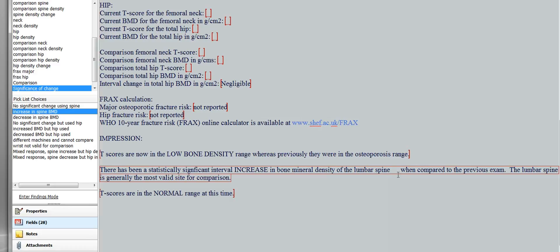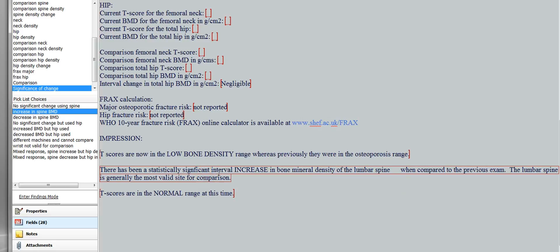I can't put a field or a pick list within an impression, so I just left a blank there. So here what you want to do is you want to enter in this blank, you'll put your cursor there, click it, and then speak in, and you'll give the bone mineral density in grams per centimeter squared and the percent change. So in this case, it's that there's been a statistically significant interval increase in bone mineral density of the lumbar spine, and you'll say of 0.01 grams per centimeter squared or 3.7%. So you'll give those two values, the bone mineral density and then the percent change, and you'll insert it right in there.